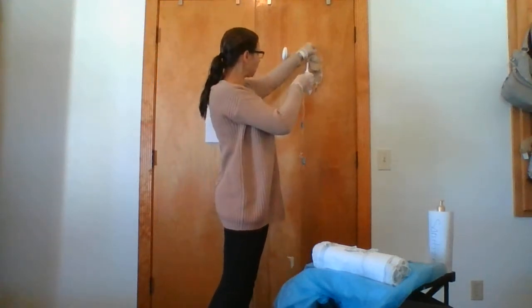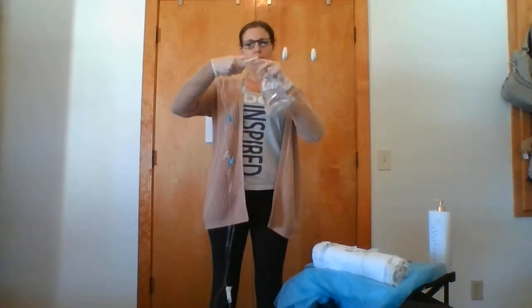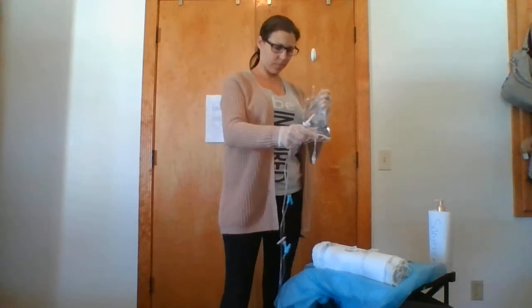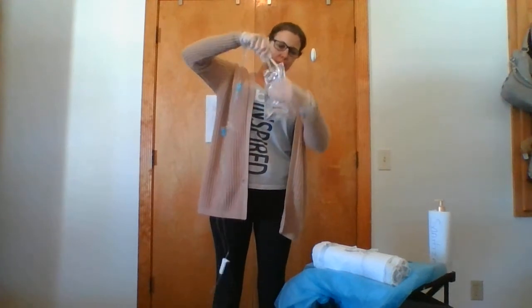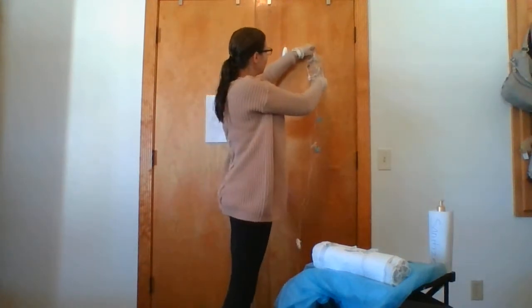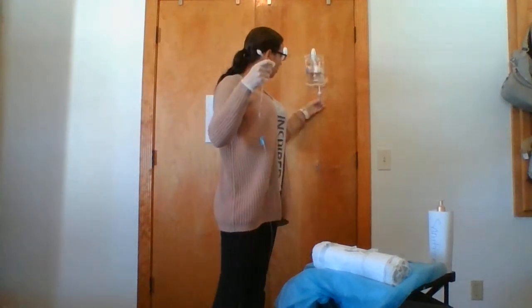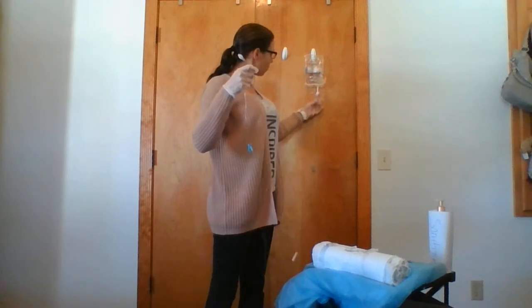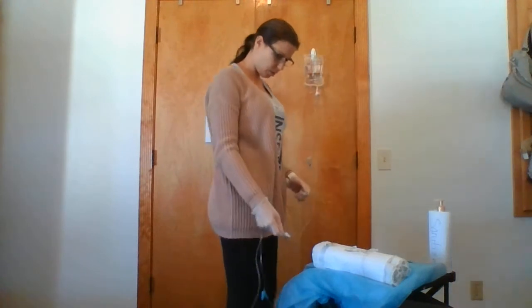I'm going to take my IV bag down. Remove the tip here, the cap. Insert to the IV bag. Make sure the roller is clamped so you don't lose your IV fluid, which it is. Okay. I'm going to fill the port here about halfway full. I'm going to open the tubing to prime slowly.